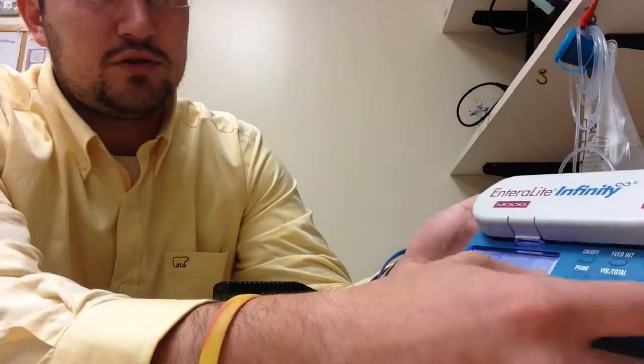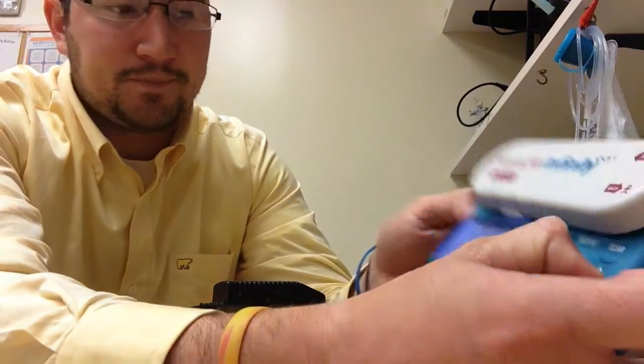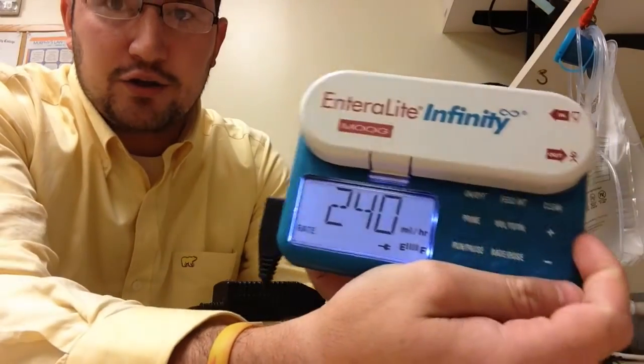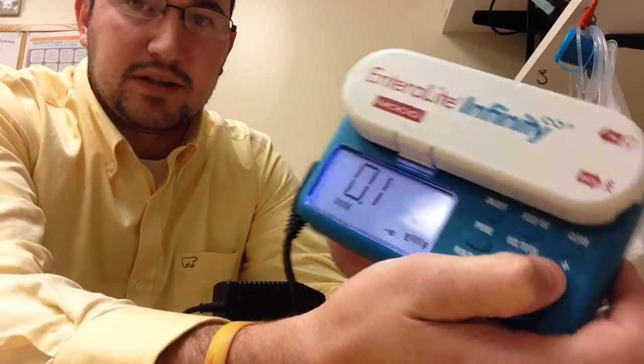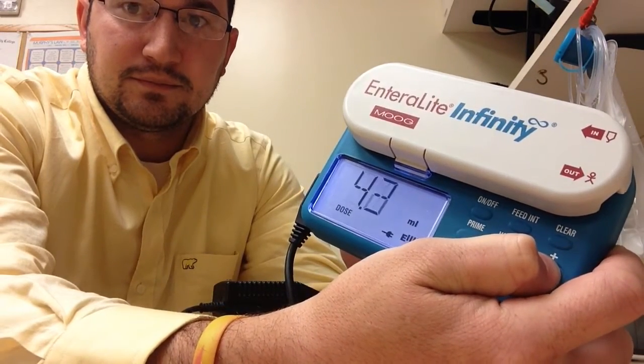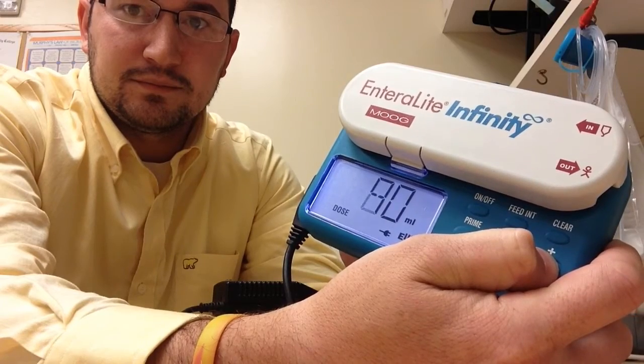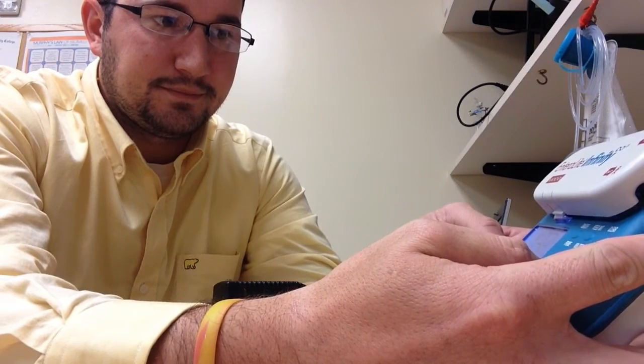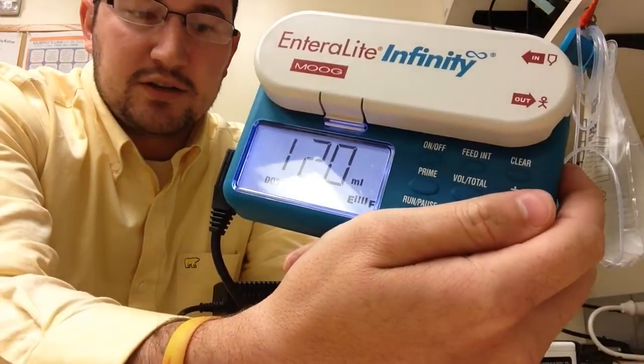So when programming the pump, you just use the up and down. Click on your rate dose button. The first one is the milliliters per hour, so we're going to take that up to 240. Now we're at our 240, and now we're going to take the milliliters up to 120. A little too far. And now we have the milliliters at 120.